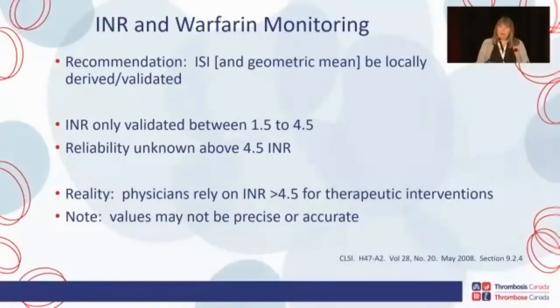All right, the reliability of an INR from any lab above 4.5 is unknown. All right, so the reality is we know in the lab that physicians use INRs greater than 4.5 for therapeutic interventions, but we do have to be cognizant of the fact that they may not be precise or accurate. Obviously, it's very high, so obviously you can take that away from it, but the actual number may or may not be accurate.